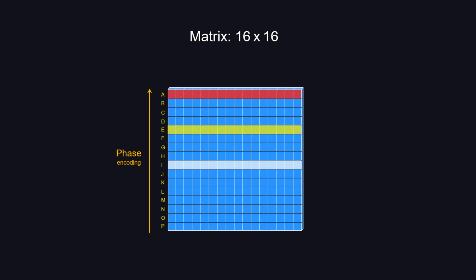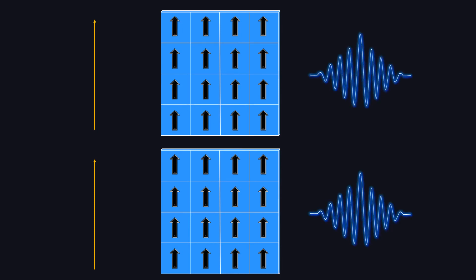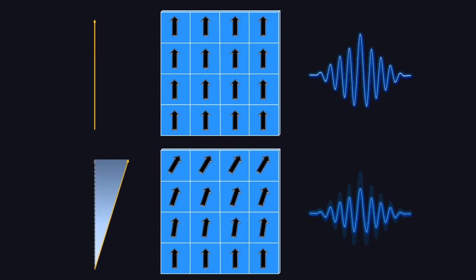The answer is, you also use a gradient. As an illustration, let's say you have two groups of tissue. Initially, everybody's in phase. So if you take the whole thing as a group, when they're in phase, you have the highest signal. As you increase the gradient, the one in the top row is experiencing the strongest magnetic field, therefore it's going to experience the highest phase shift.